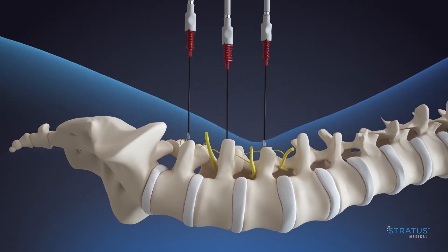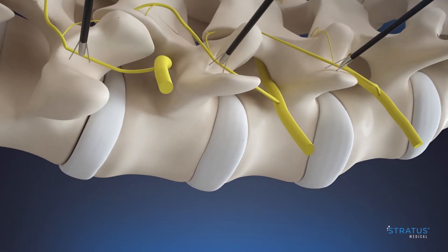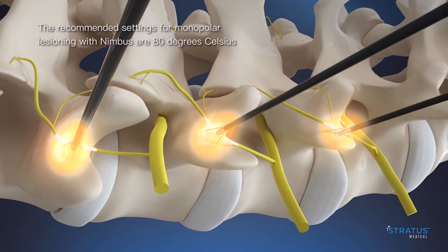Insert the RF probe into the Nimbus connector lumen ensuring it is fully seated. Complete motor sensory stimulation as desired. Apply prescribed RF energy to achieve the desired therapeutic effect.